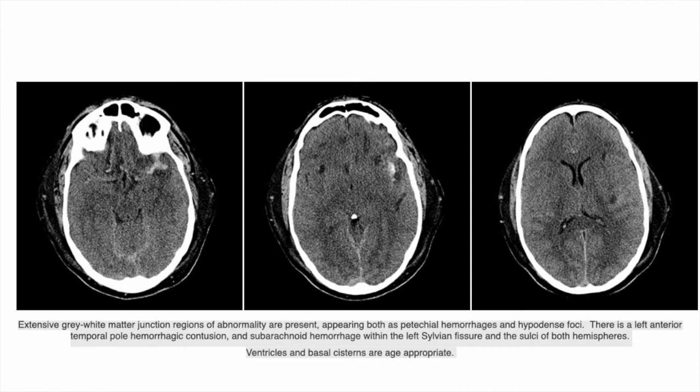Sometimes the CT scan can appear negative, and it also depends on the experience of the radiologist who is reporting this kind of traumatic brain injury. Sometimes it can be very subtle and difficult to diagnose, but you have to always think of that.